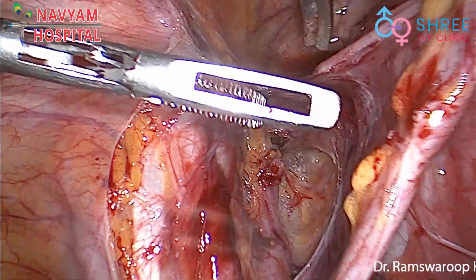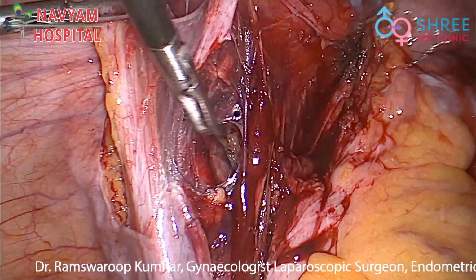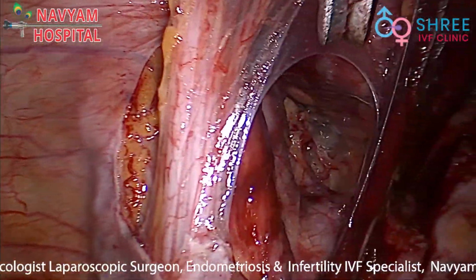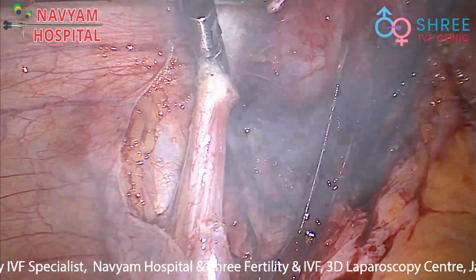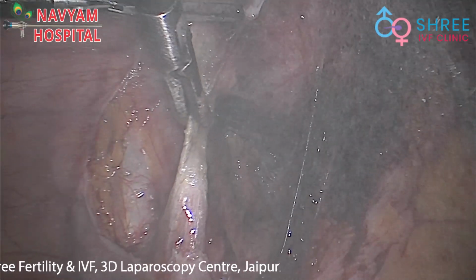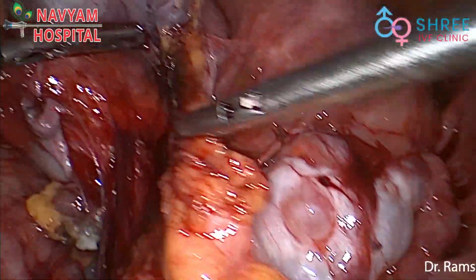Then a window was created for the IP ligament, and proper coagulation and cutting of the IP ligament was carried out, and this will reduce the vascularity of the ovaries, fallopian tube and the uterus. By this step, we have achieved 50% of the blood circulation to the uterus being gone.